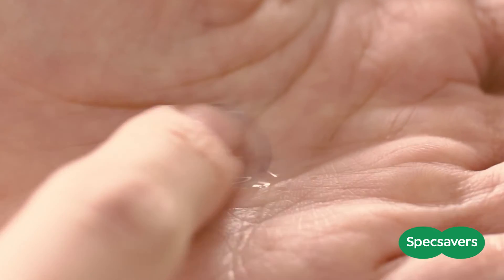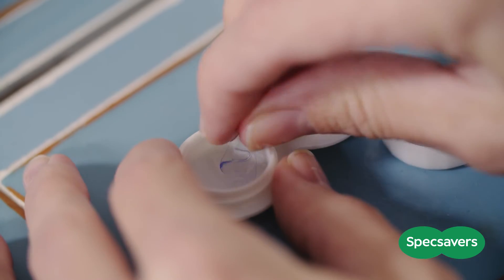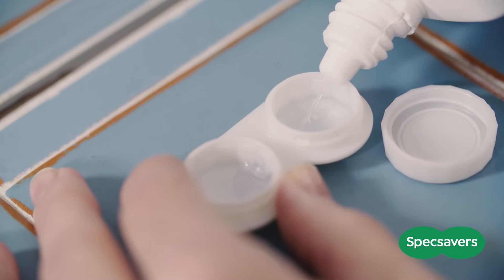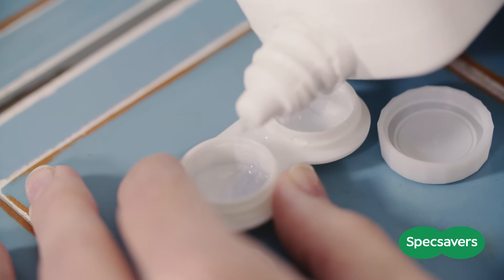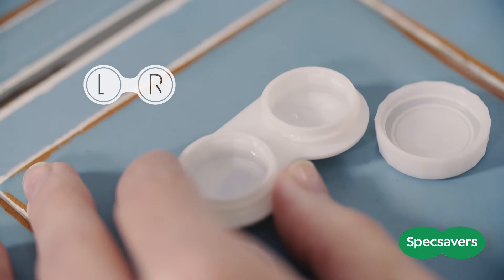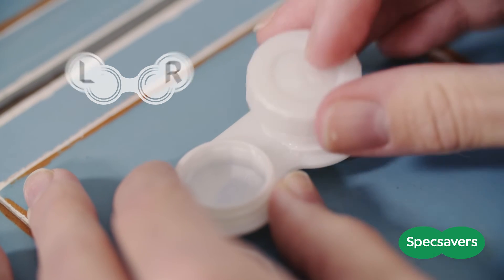Once you're happy that it's clean, you need to put it into your contact lens case for storage. Place your lens in your clean case and cover with fresh solution. Never top up old solution. Make sure you put the correct lens in the correct side — R for your right eye and L for your left.